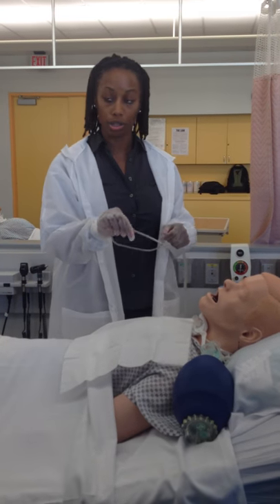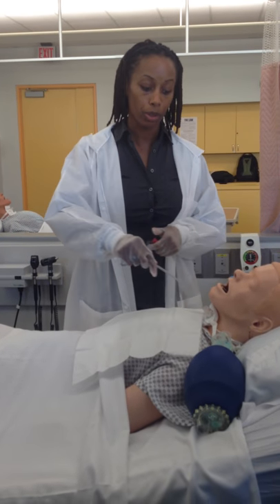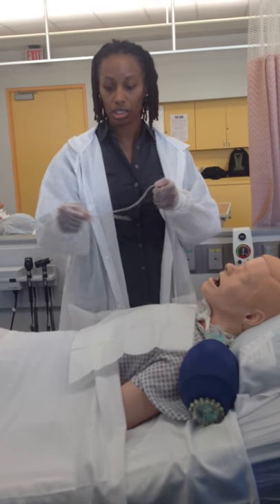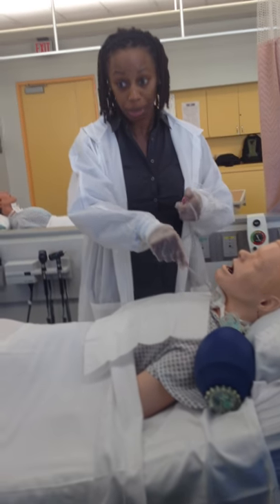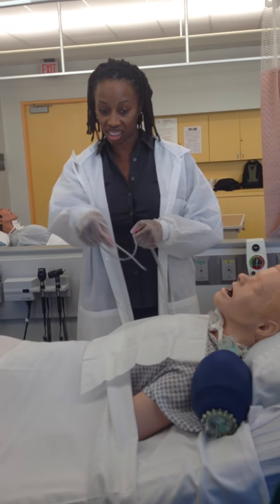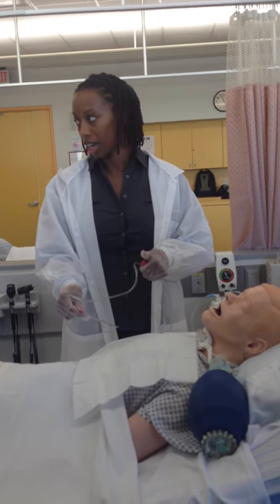If they still have a lot more junk and still sound congested, keep passing until they feel better or until their oxygen saturation improves. You only do it twice, give them a breath, give them time to recover, do it twice again, give them breaths. If on your way out you feel like you have a mucus plug, stay on the suction to pull it out. Once you feel that you have one, keep your finger on it and pull it out — that's how you get it out, and you'll see it dangling on the end. That's why I put the drape down.